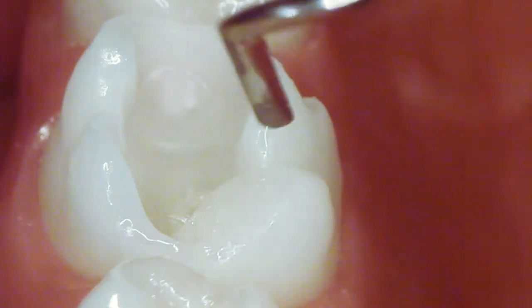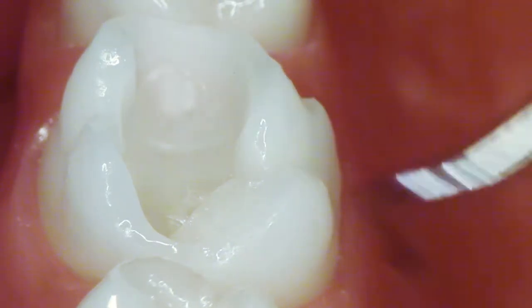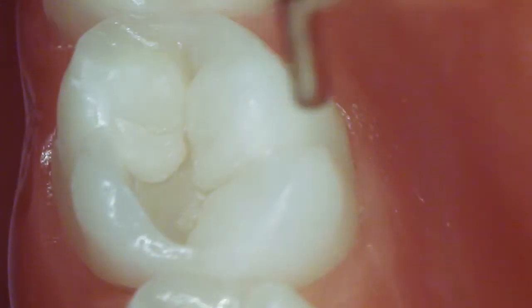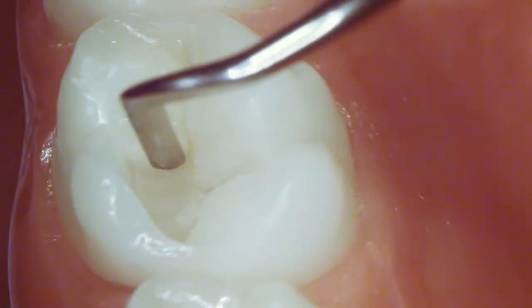The combination of excellent adaptation and sculptability enables simple and targeted modeling of Ceramax with the SphereTech technology.